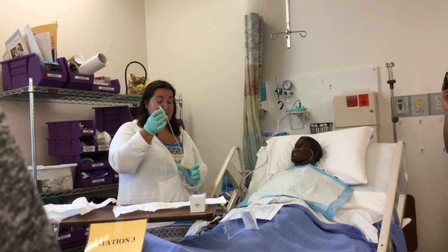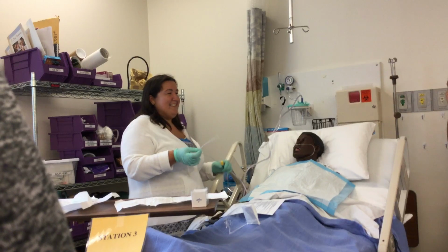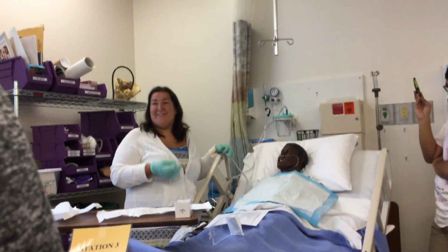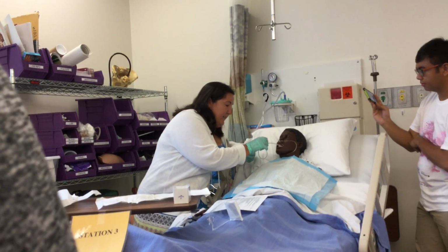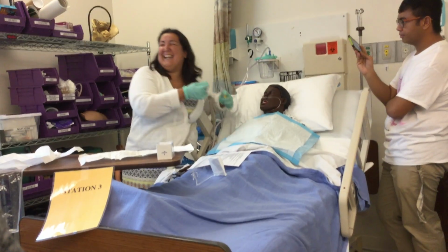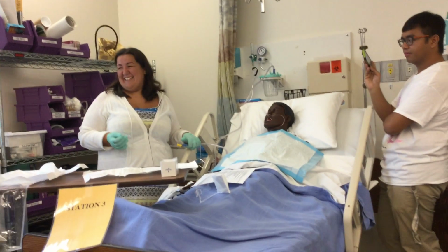And then the last thing you can do, which grosses everybody out, is you want to clean this, and then you could clean their mouth. And yes, your mouth is dirtier than your nose because your mouth has a lot of bacteria. Your airway is actually sterile unless you're sick. There's really not much germs in there. So your mouth you can suction. You can go on the side. It's gross. Is that what you said? Yes, it's the same tube. You are rinsing it in the saline. And you're rinsing it in the saline, yes.